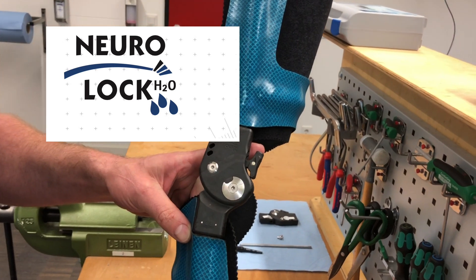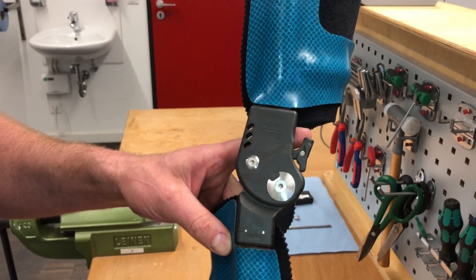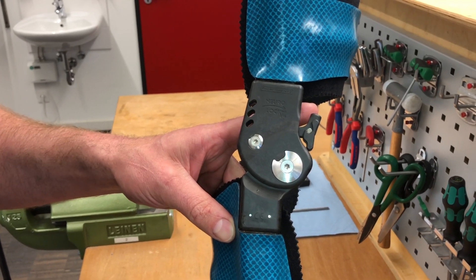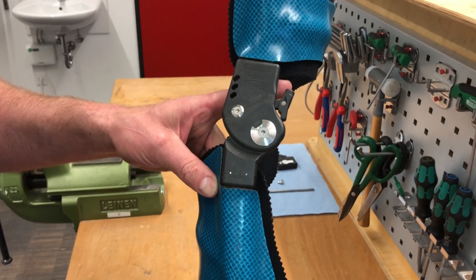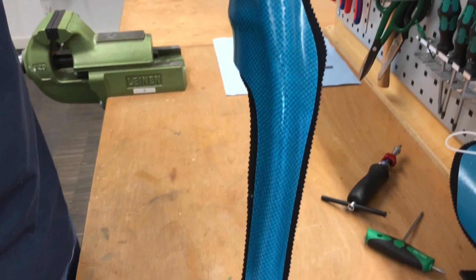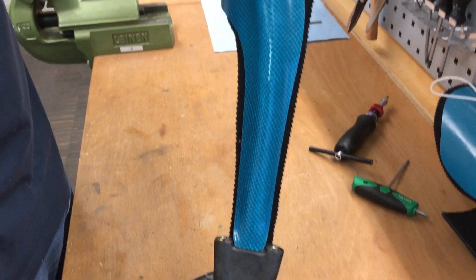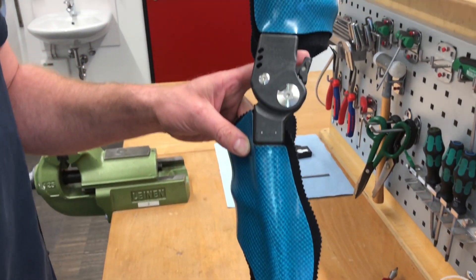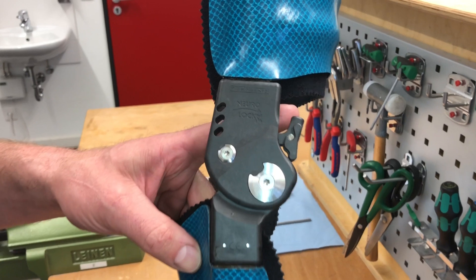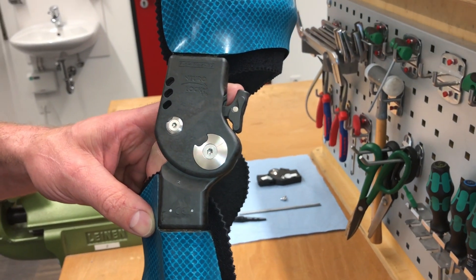Waterproof knee joint. So we can now make waterproof KFOs and not only waterproof AFOs, right? That is right. We now also have a knee joint for the Neuroswing H2O and we can build KFOs with it. I am very happy about that, because the demand for such a joint has been there since the launch of the Neuroswing H2O, and I am very glad that we can offer it now.